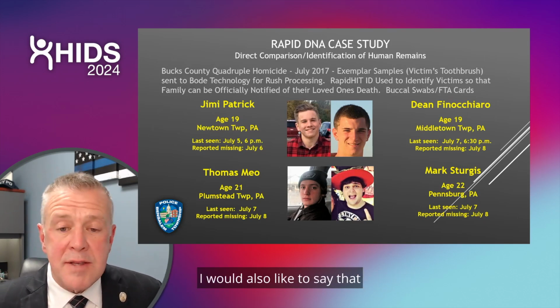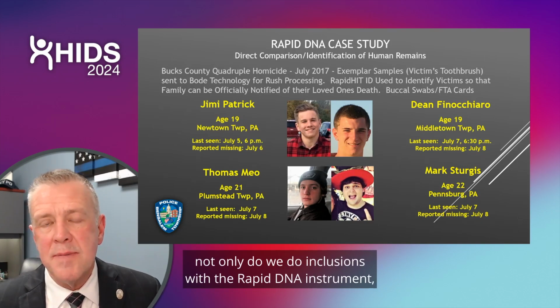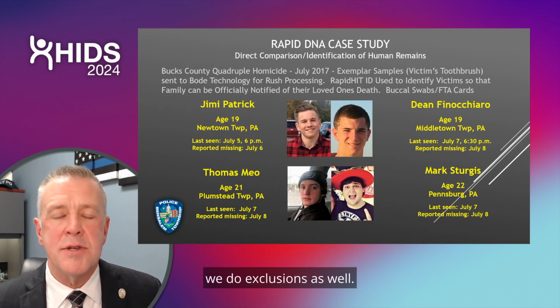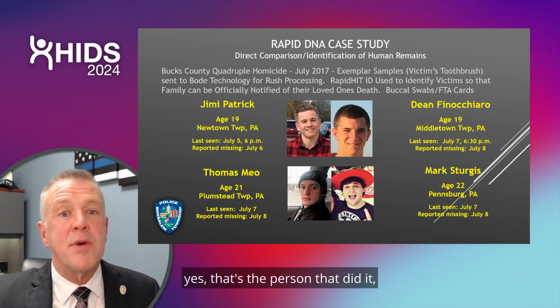I would also like to say that not only do we do inclusions with the rapid DNA instrument, we do exclusions as well. We've had several cases where somebody says, yes, that's the person that did it.